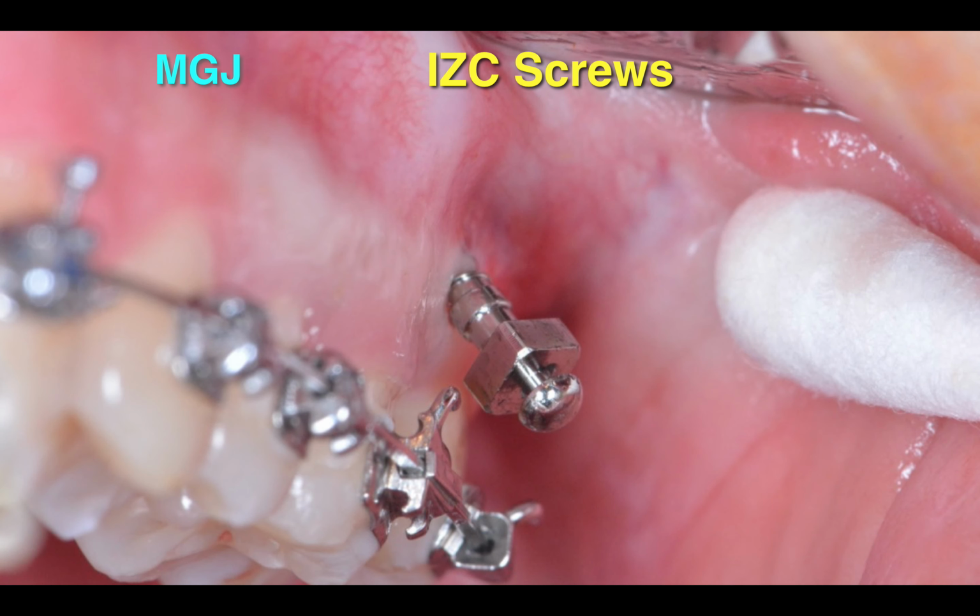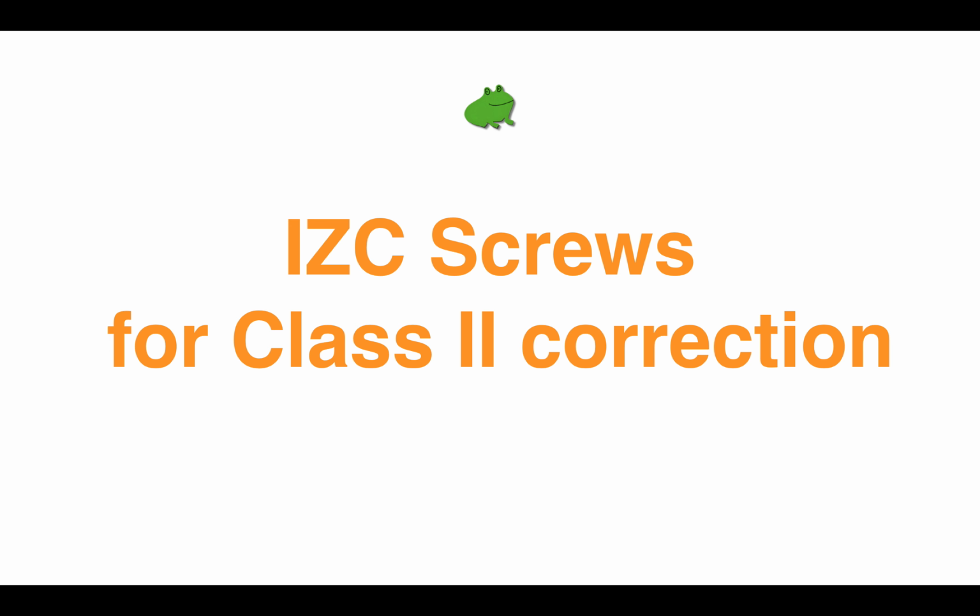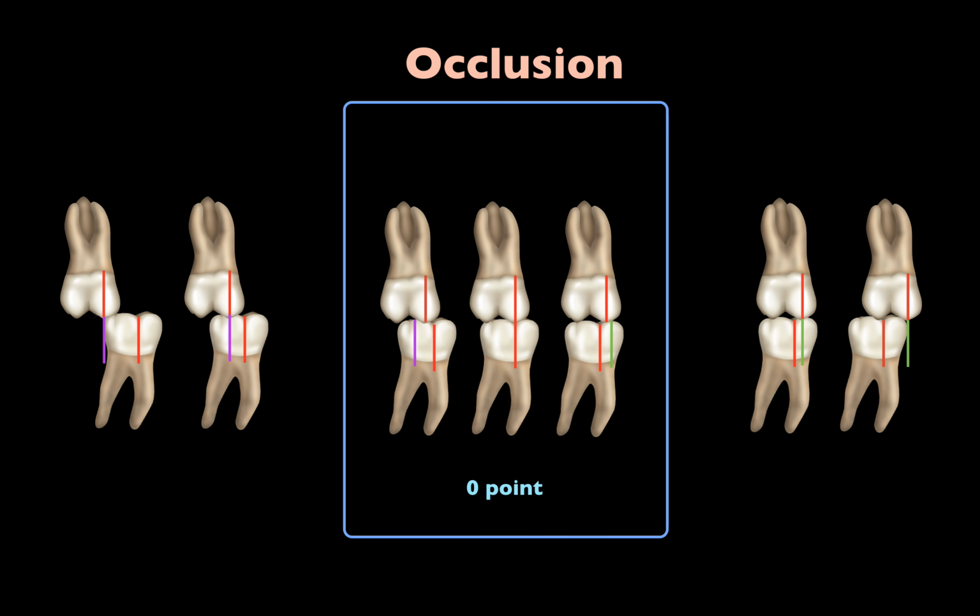In the clinical part, I would suggest you leave the screw head with about 5 millimeter of soft tissue clearance. You can put it in movable mucosa or attached gingiva. It doesn't matter, as long as you leave the head a little bit longer, about 5 millimeter clearance. So let me show you the application for this IZC screw.